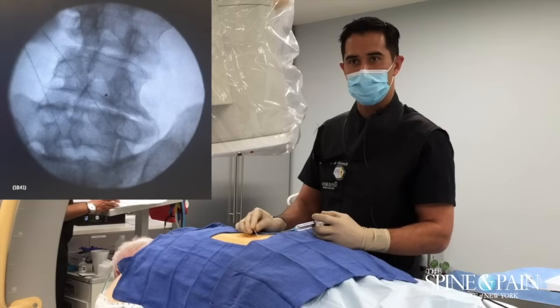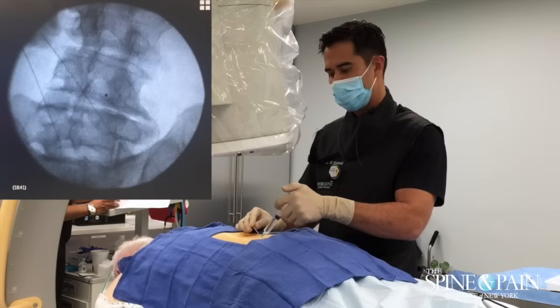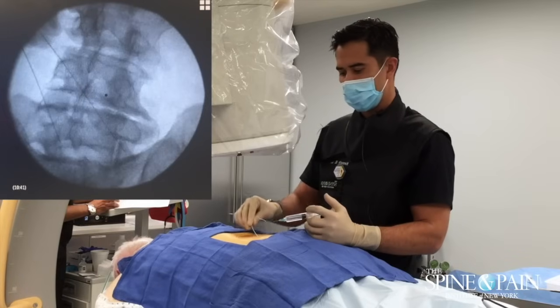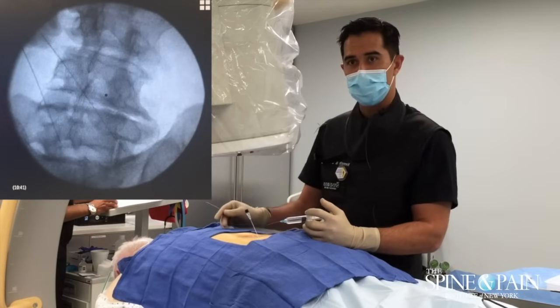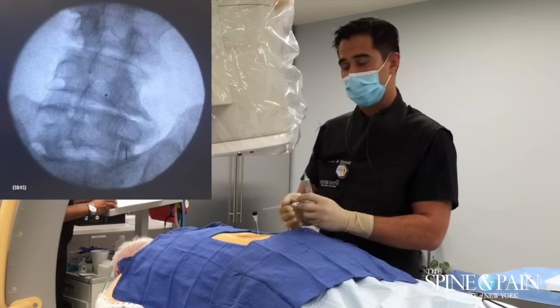We're going to use a two-needle technique which is going to give us a bigger lesion. We're down here at the superior articular process at S1, and this is going to get our L5 dorsal primary rami.